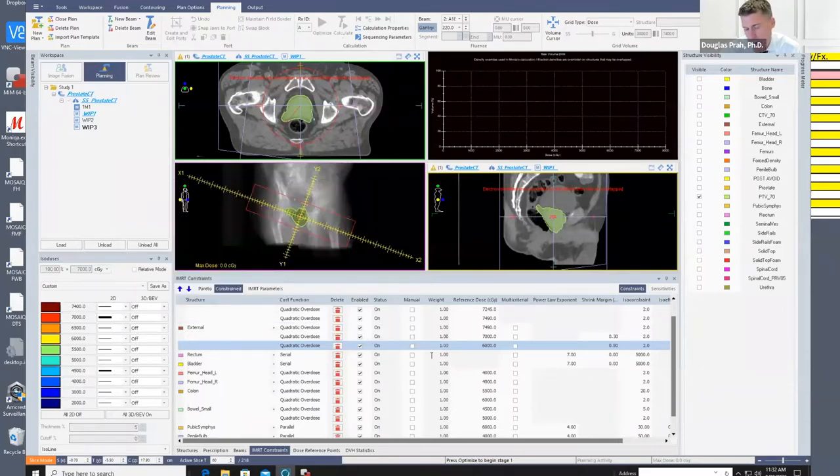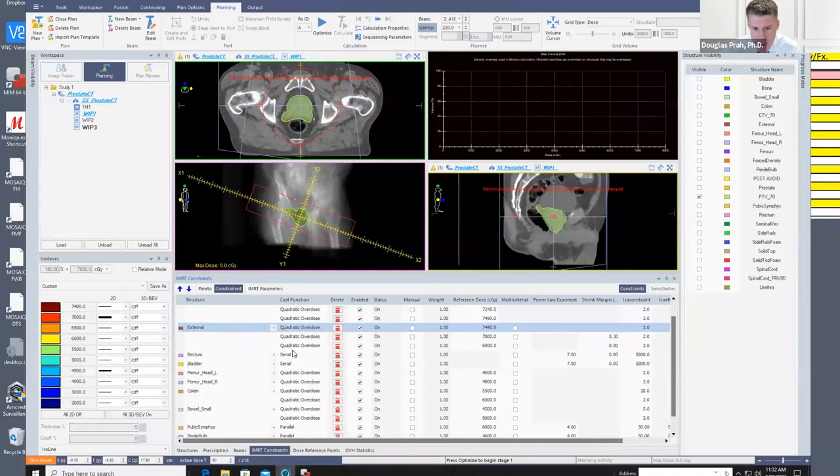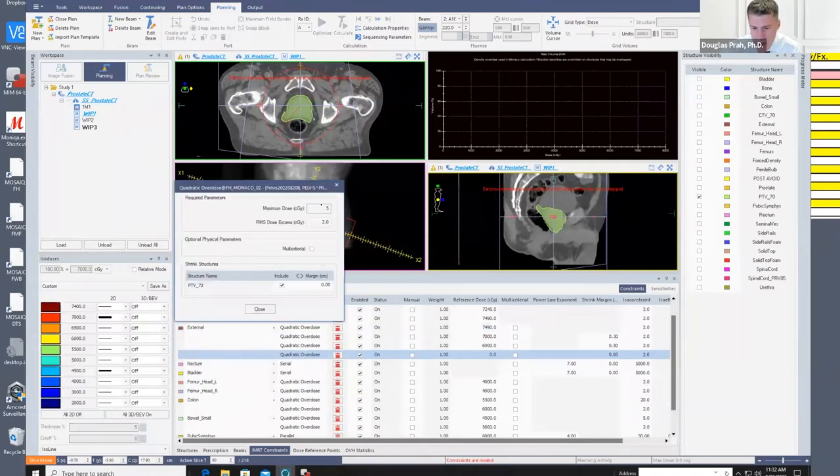This doesn't matter quite so much for what you're using for the shrink margin. You'll see that it's still going to push the dose down pretty well anyway. But if you push down too hard, well, let's do that. What you'll see is that the max point dose in the plan is going to start to creep up pretty fast. Really, when it comes down to max point doses in plans, it's the balance between dose gradient, the dose falloff around the target, and the max point dose. So the tighter dose you want on a structure, the higher max dose you need to be willing to accept.